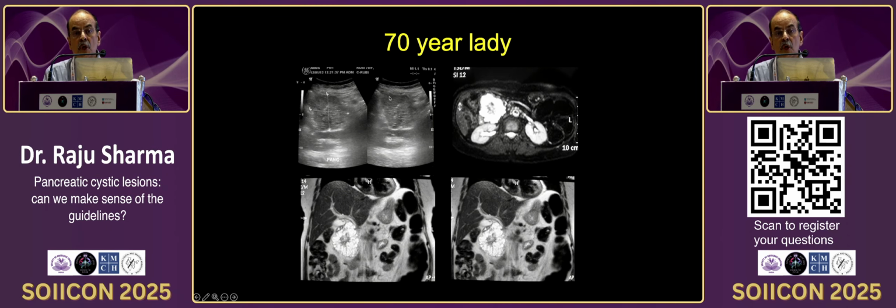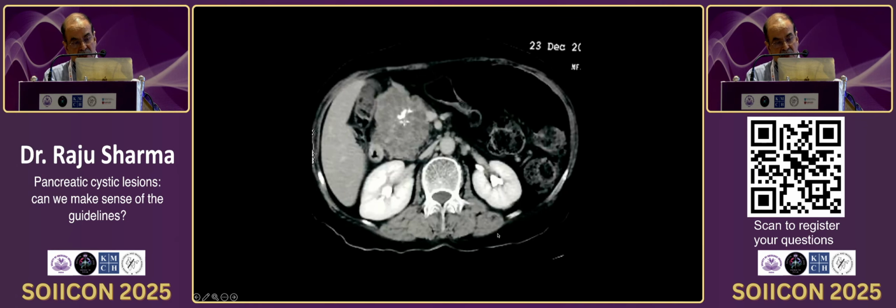It may appear solid on ultrasound because this contains numerous cysts, and there are so many interfaces for the ultrasound beam that it may actually look solid. It's on MR that you can actually identify the microcystic nature, the innumerable cysts that this lesion has on a T2 weighted image, and this typically shows you the central stellate hypointense scar. And with this constellation of findings, you're almost certain you're dealing with serous cyst adenoma, and if the patient does not have too many symptoms, this can be kept on observation.